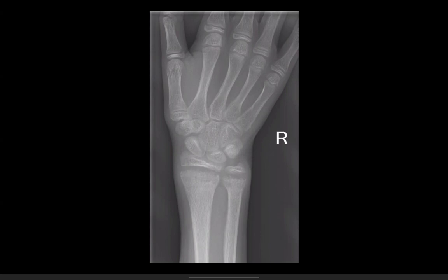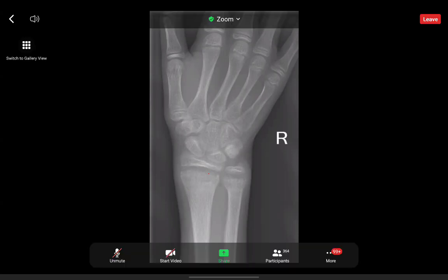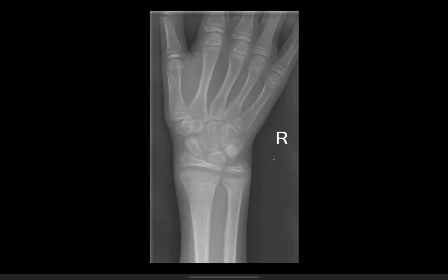And remember why this happens is because in rickets, it's the failure of the cartilage to mineralize at the physis and undergo resorption. So you get disordered proliferation of chondrocytes in the hypertrophic zone here. So the chondrocytes do not mineralize, are not allowed to cross the physis, and they stack up at the metaphysis, which is why you get this widened, splayed, and frayed appearance. And ultimately, that results in poorly mineralized bones.